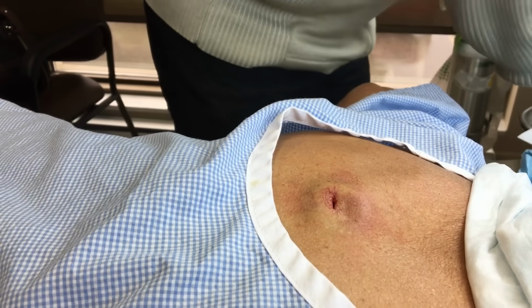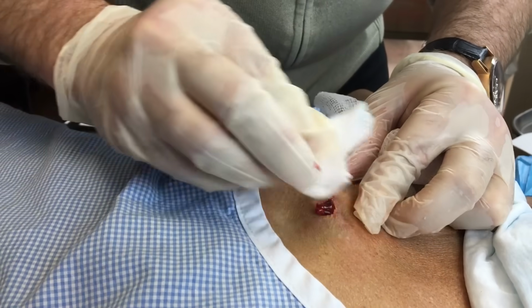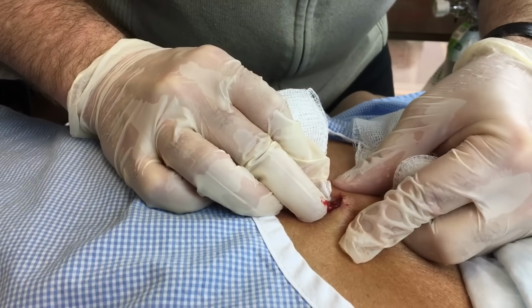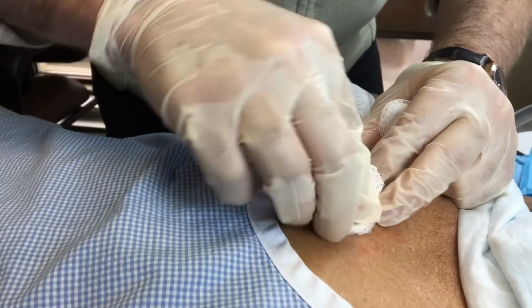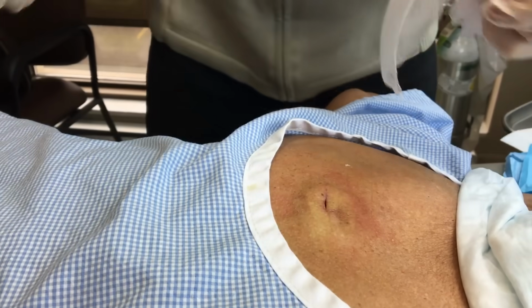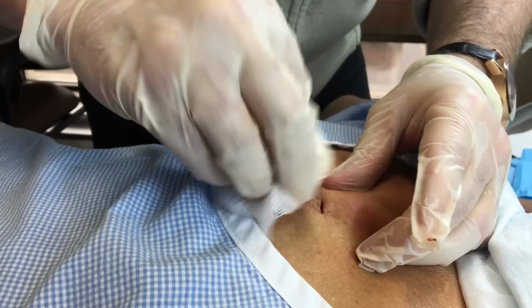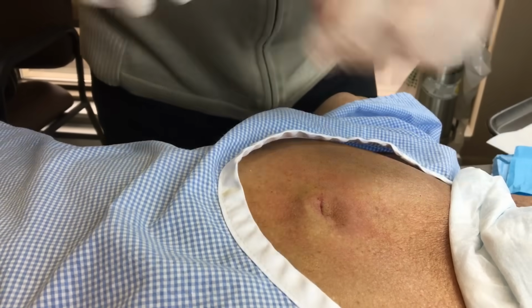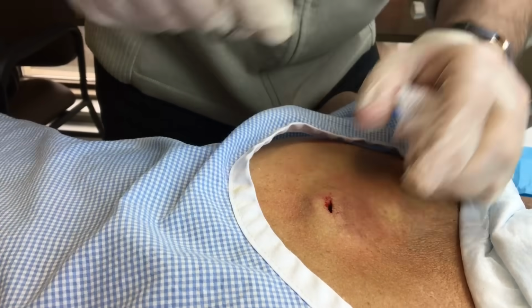And the other part too with this is because we're going to be packing this, and there's an option there as well, because there are some newer studies showing packing really doesn't help healing time at all. But I tend to always use it still, only because I find a lot of these will sometimes still ooze a lot. And from a purely hemostasis perspective, I like to have the packing in. That'll just be for like half a week or so. And the other advantage it creates is this issue of irrigating it out and getting every last bit out. When you're going to be removing the packing, a lot of times if this is more loculated, those loculated chambers will break down, and when you replace the packing in a day or so, those will collapse completely and drain then.